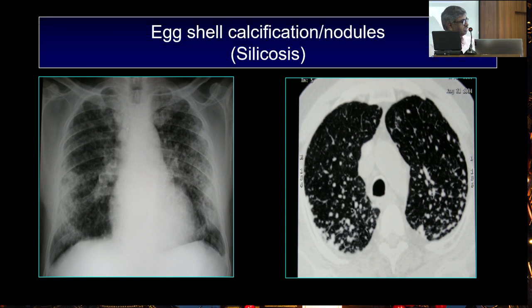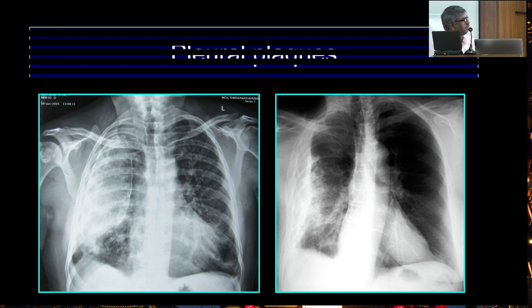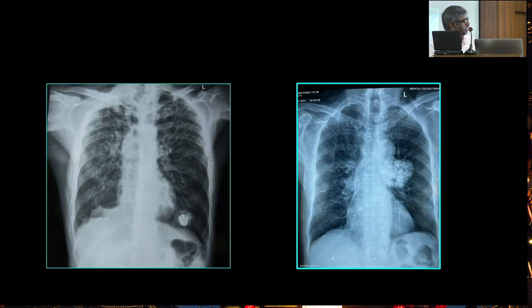So that's also, again, silicotic diseases are actually not rare in our specialty. So these both are called pleural plaques. You are seeing a lot of dense calcified shadows. These are now becoming rare because of our adequate early treatment of tuberculosis. These are actually old treated tuberculosis, including pleural involvement. That's called pleural plaques. And this X-ray is also a spotter.